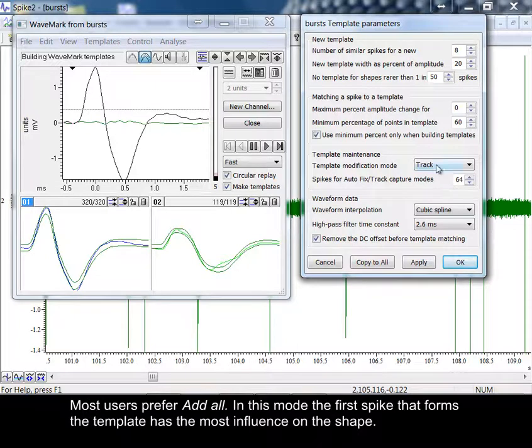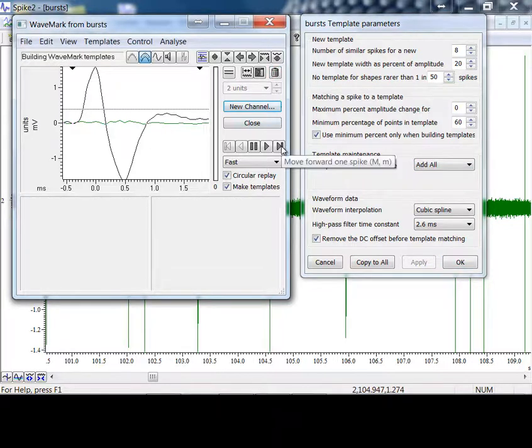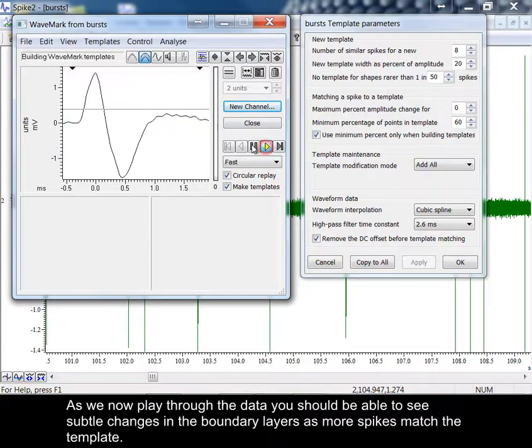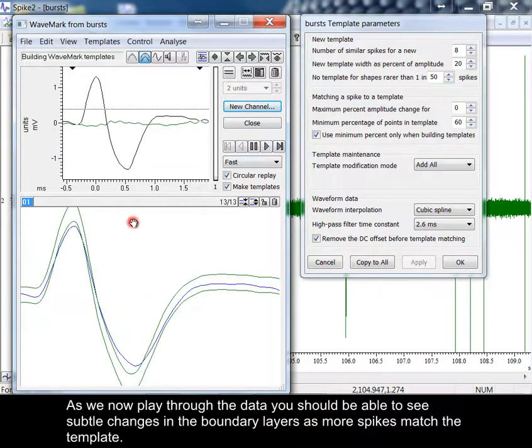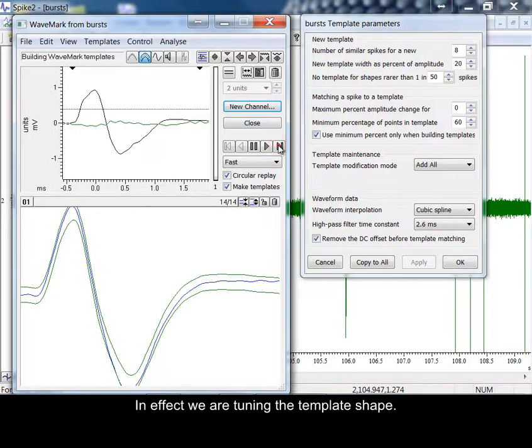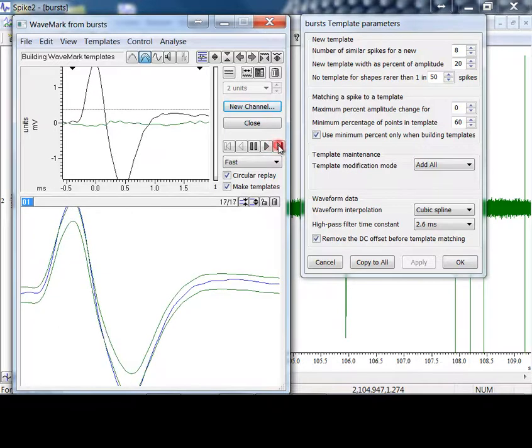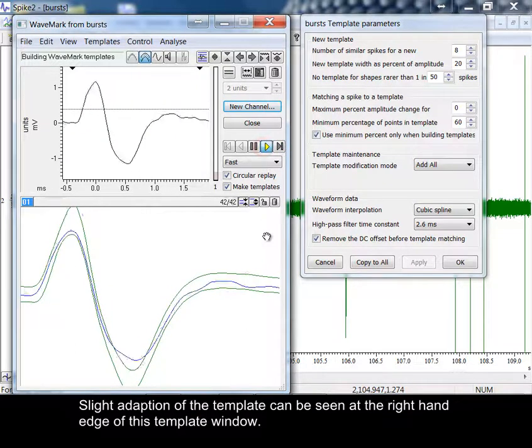Most users prefer add all. In this mode, the first spike that forms the template has the most influence on the shape. As we now play through the data, you should be able to see subtle changes in the boundary layers as more spikes match the template. In effect, we are tuning the template shape.